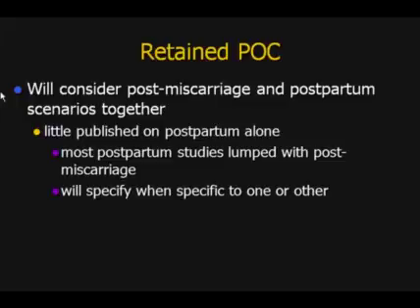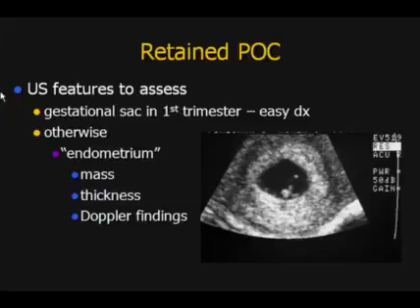So we're going to consider the post-miscarriage, that is in the first trimester, and the postpartum scenarios together. There's less published on the postpartum patient alone. Most of the postpartum studies lump the post-miscarriage patient, that is the first trimester, together. There are some studies that included just the first trimester, but we're going to lump them together. And when it's important, I'll specify if criteria apply more to one or the other.